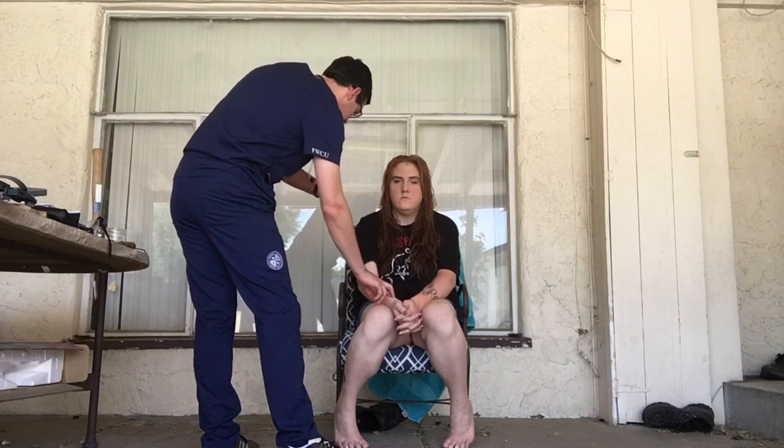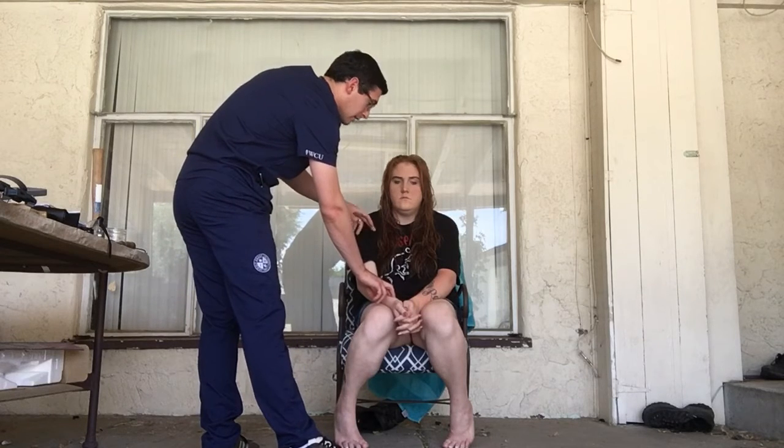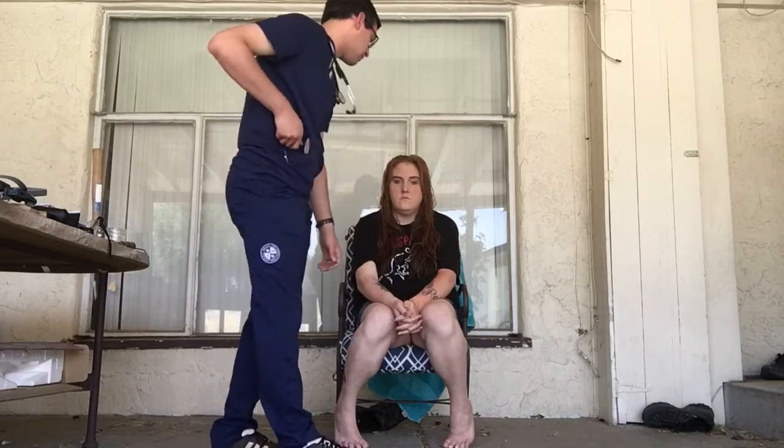116/72. I'm going to take your pulse. I do this for one full minute and count respirations as well. So pulse is 80, respiration 16 per minute.